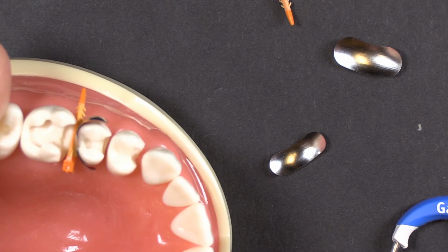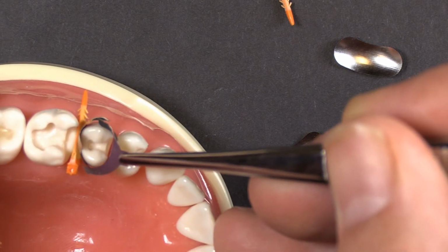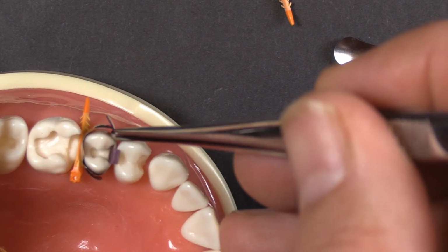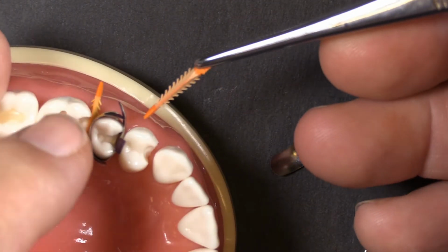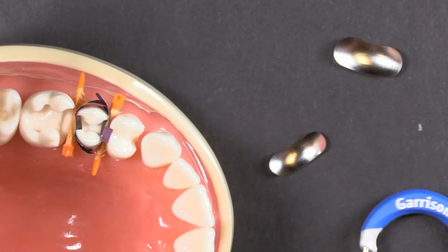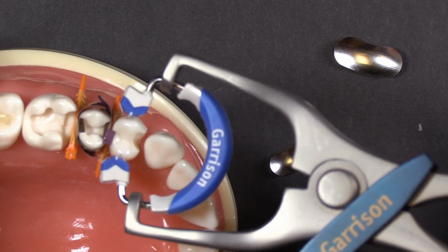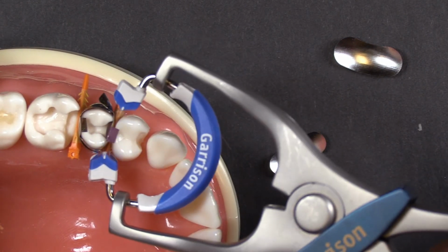The band was not held in place by the wedge, and that was one of the questions from later on: how do I keep that band from floating around on me when I'm placing the hardware? And that's making sure that you've got a good grip on the band with the wedge down by the gingiva, and that will secure the band, preventing it from sliding around. So this should go a little better.